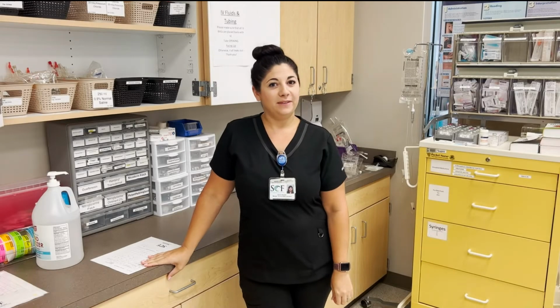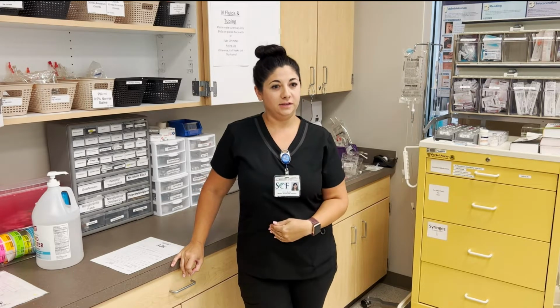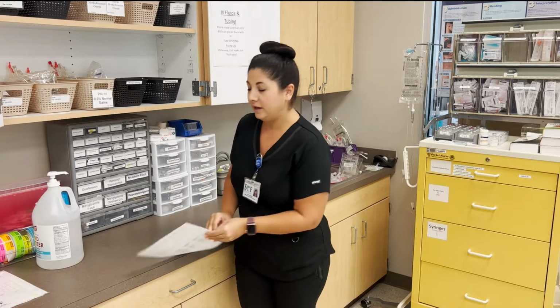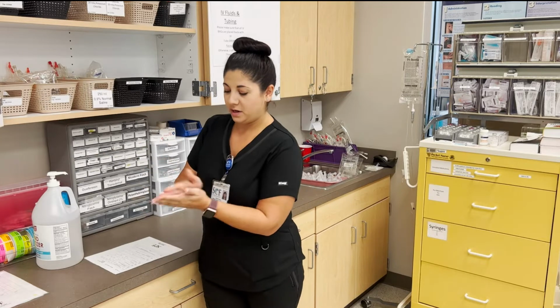We are going to be giving meds now. I have already assessed my patient. I have taken vital signs. I have assessed the need for any PRN medications that they might want. And I am coming to the med room. I'm going to wash my hands.